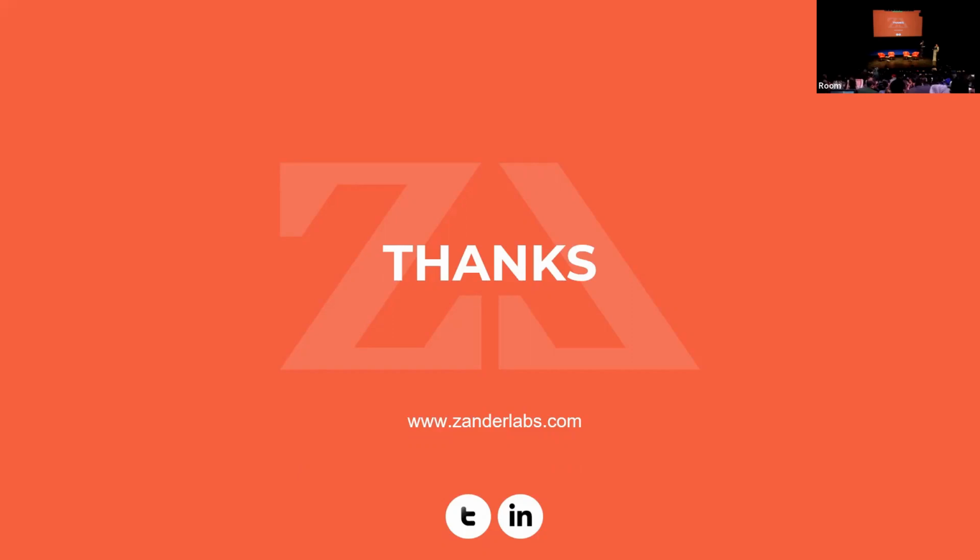Hello, thanks for the talk. Just a short technical question. When you do a high pass with a low frequency, you usually have a pretty long filter. But then if you have pretty strong artifacts that happen quickly, applying this filter would actually propagate this artifact further. So my question is whether there's some consideration for this and how one can handle it.